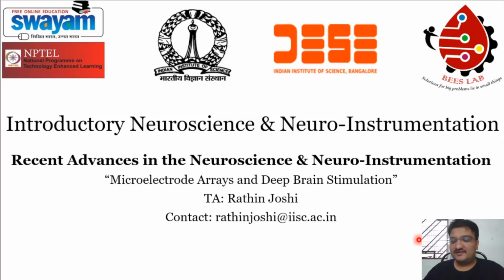So far, what we were doing is recording electric potentials, or biopotentials, from your scalp. Now we are providing a small current to your brain and observing the response. This is entirely one more new area of research, which is known as deep brain stimulation, or direct electrical stimulation, etc.